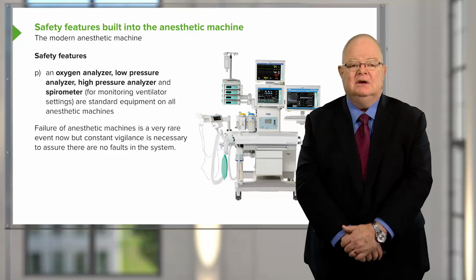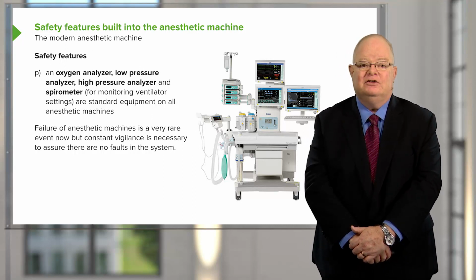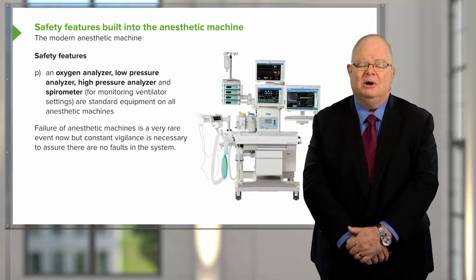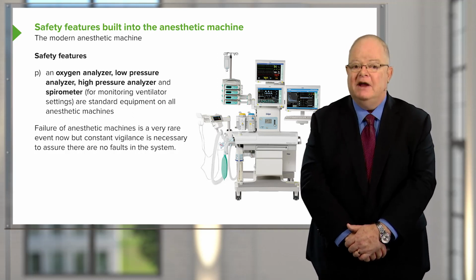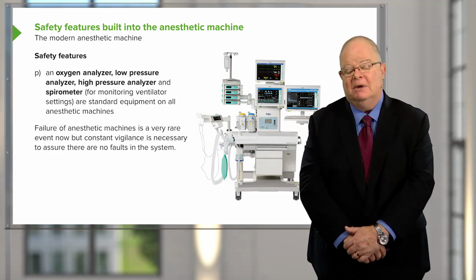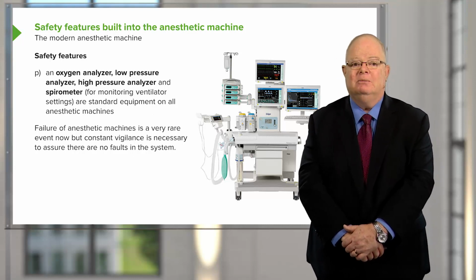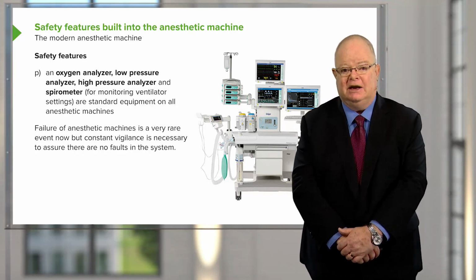However, I'm aware of 2 events in my own hospital system in the last year that could have been disastrous. In one case, it was my own machine, and the entire breathing circuit and Sodalime canister fell off the machine, landed on my foot, which was not a pleasant experience, but more importantly, left me with no way to ventilate the patient or deliver vapors to the patient. I was able to quickly change over to a bag and mask system and start a propofol infusion, so no damage to the patient occurred, but it was certainly a scary event. And there's been some changes to that machine to try to prevent it again in the future.